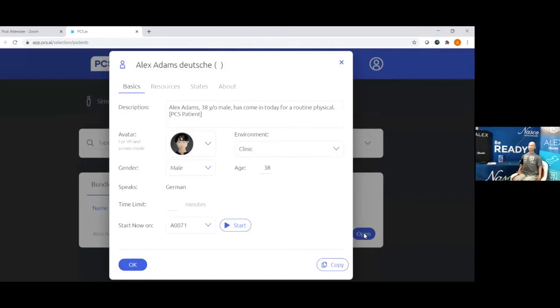And when you open that scenario up, you would go to, say, your states. So he has no speaking capabilities inside of him at this moment on the international side of it. It's more of a blank template, allowing you or your users to go in and type in your own language the questions and answers that you would want to help him build his artificial intelligence. Fortunately for us in the US, we all speak English, and we have over 400 units that are out there right now. So every time we speak to Alex or anyone speaks to him, his brain continues to learn.